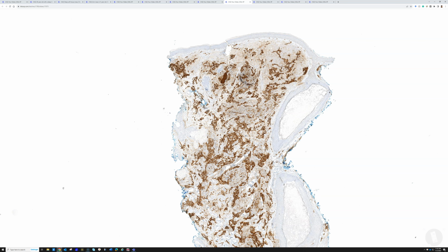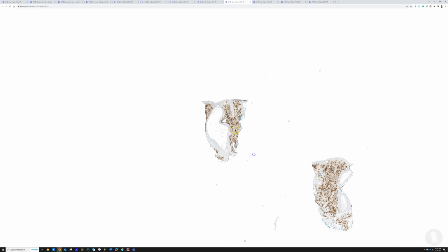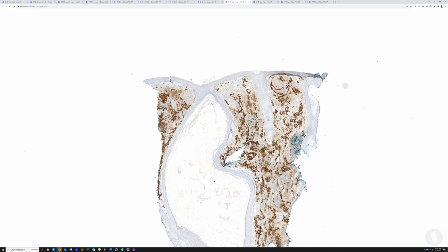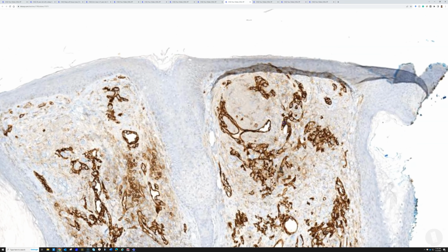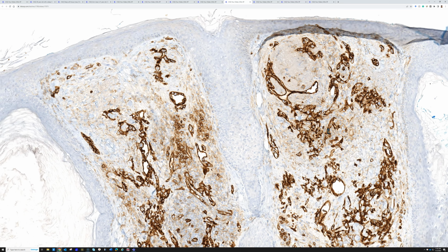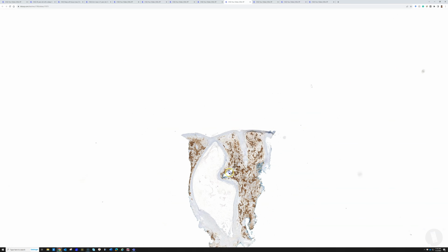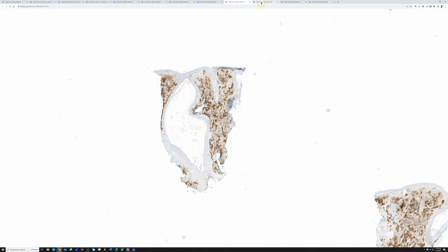So this is a reminder to look at the whole slide. Just because you find one diagnosis, don't stop looking, and always be careful. And if something doesn't seem quite right, look a little closer. And this is a very scary case because it would have been so incredibly easy to overlook this. But thanks to the skilled eyes of my very brilliant colleague, this case was diagnosed and detected. And so this was angiosarcoma with a ruptured cyst in the background.